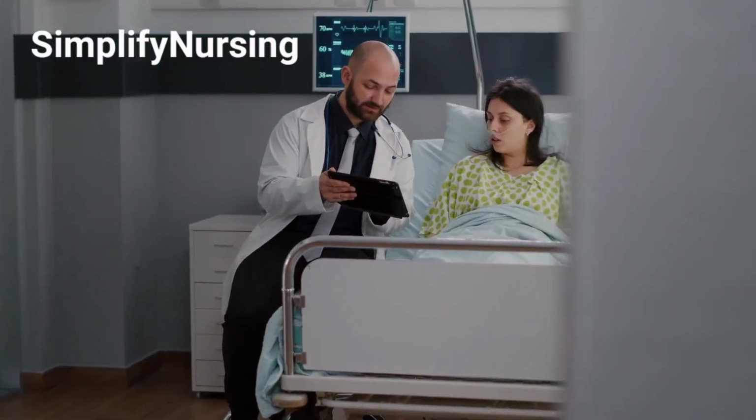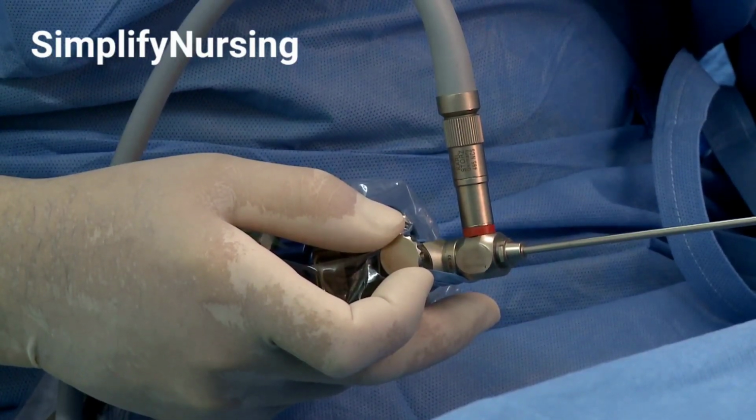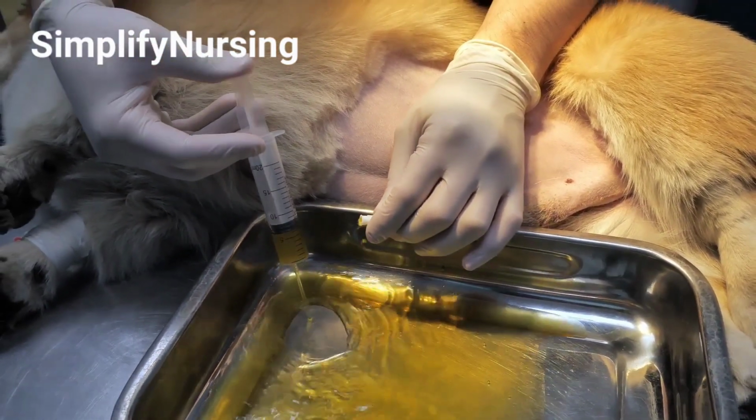First off, what is cystoscopy? Cystoscopy involves inserting a cystoscope, a thin tube with a camera and light, through the urethra into the bladder to check out the interior lining. It's a key tool for diagnosing and treating various urinary issues.